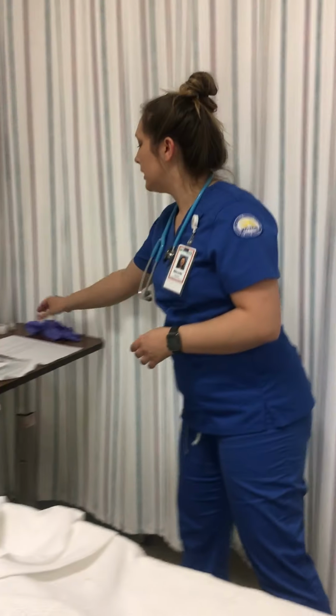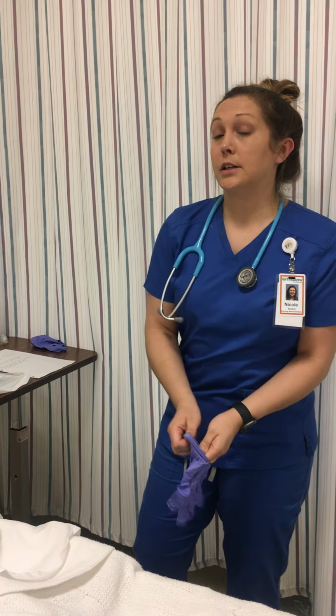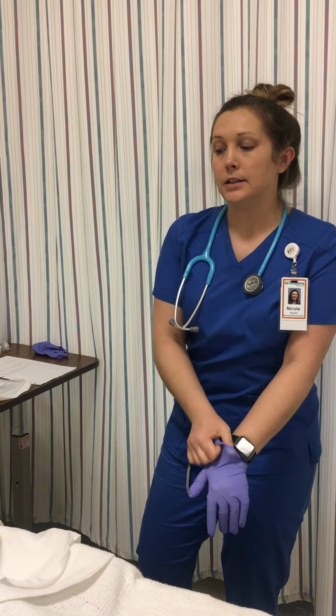So I have an order to insert an NG tube for intermittent suctioning due to no bowel movements for 8 days. So I'm going to come in the room, perform hand hygiene, and put on some gloves. Prior to inserting the NG tube, I'm going to assess the patient. First I'm going to assess his abdomen.